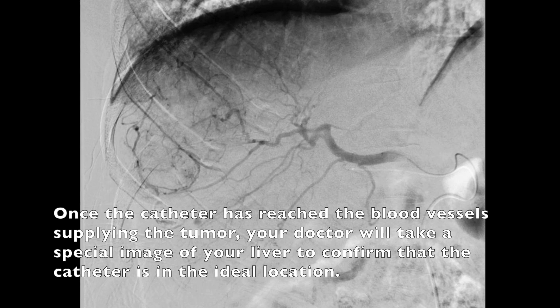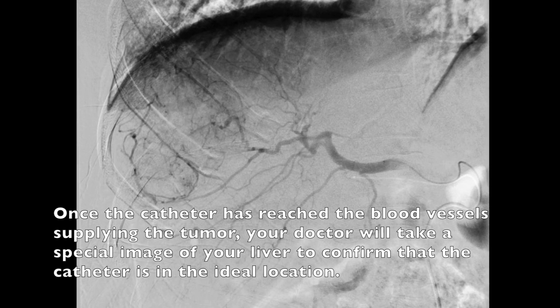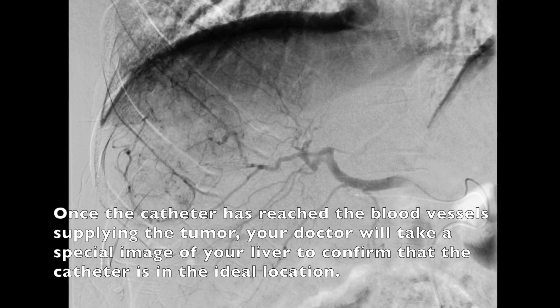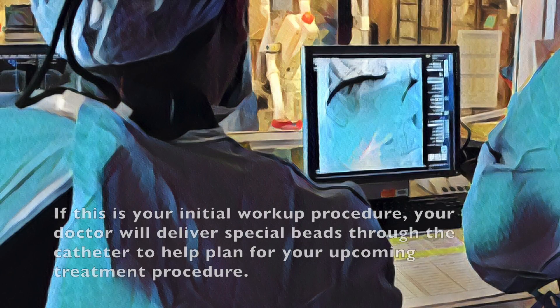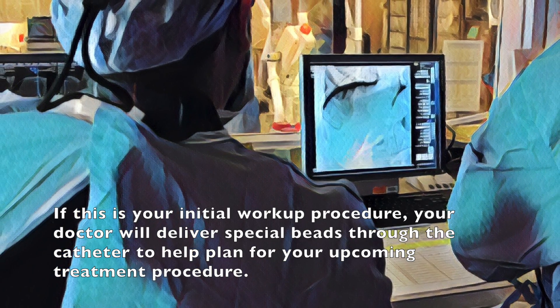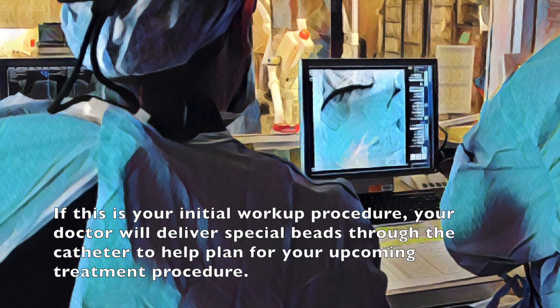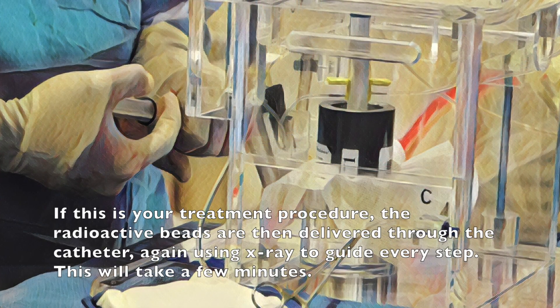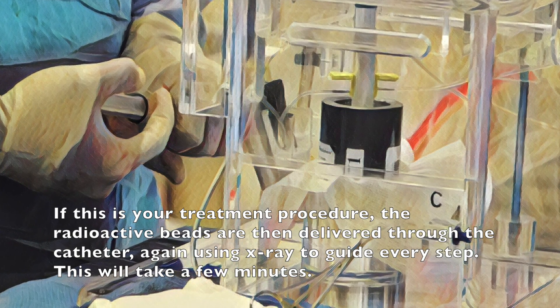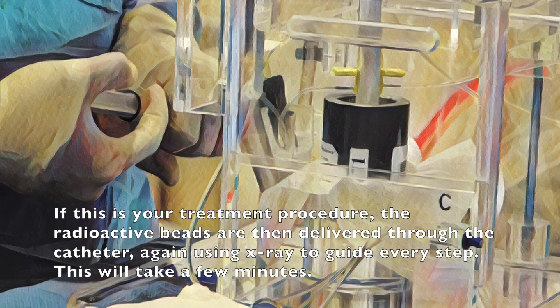Once the catheter has reached the blood vessels supplying the tumor your doctor will take a special image of your liver to confirm the catheter is in the ideal location. If this is your initial workup procedure your doctor will deliver special beads through the catheter to help plan for your upcoming treatment procedure. If this is your treatment procedure the radioactive beads are then delivered through the catheter again using x-ray to guide every step.